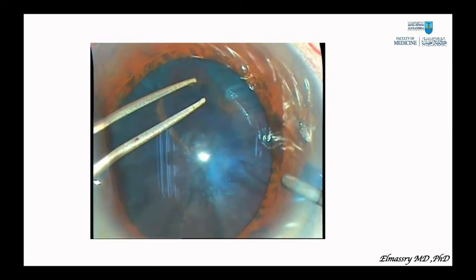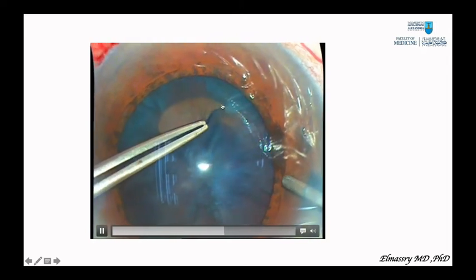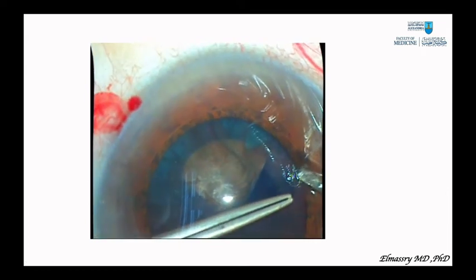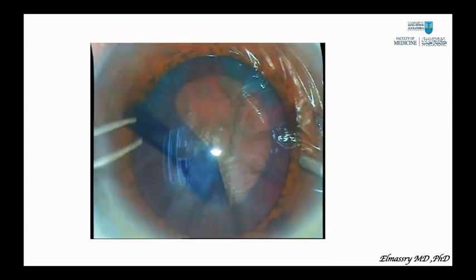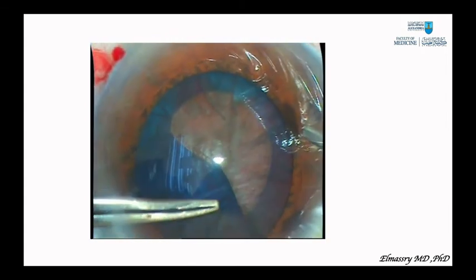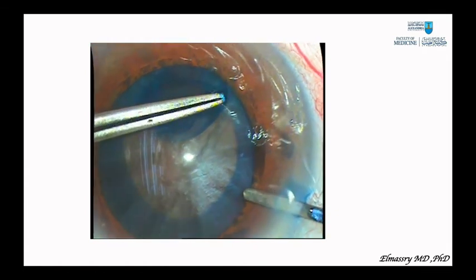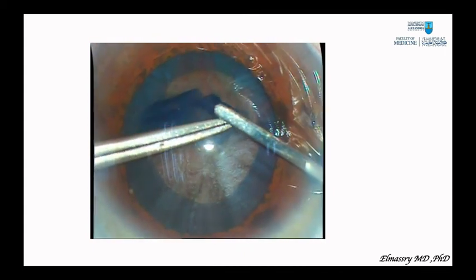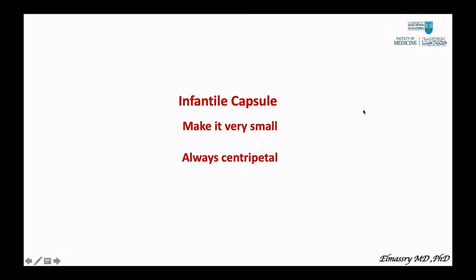Again, you are pulling in the direction of 180 degrees against the tear, which changes the direction of the capsulorhexis, and then you can continue as usual, taking care. In some cases, if you have a hypermature cataract, you may face the Argentina flag sign, and in this case, for the beginners, our advice is to convert. But if you can complete the rhexis, you can continue phaco if you have a soft nucleus. As you see here, the nucleus is very hard, it is nearly a black cataract, and the capsulorhexis now is totally completed.